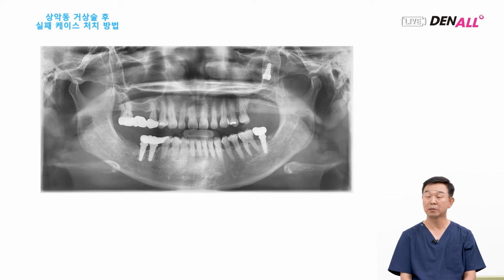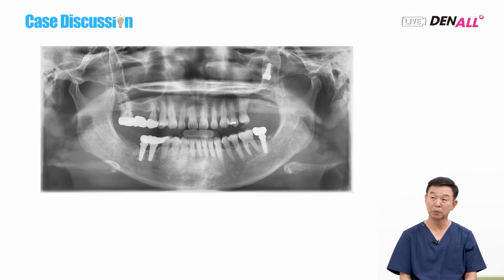When an implant is in the sinus, the most basic principle is to remove it as soon as possible because it can be removed more easily. If the patient is lost to follow-up or if you're not confident in doing the procedure, as time passes the implant will be surrounded by granulation tissue and it is difficult to detect the implant and very challenging to remove it through the lateral window approach. Whatever the technique may be, the first priority is to remove the implant.